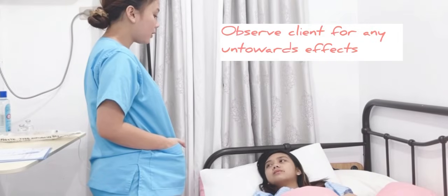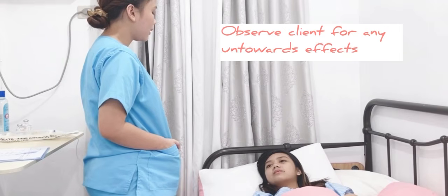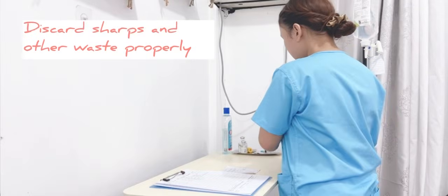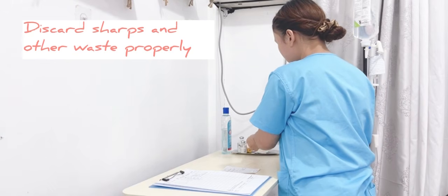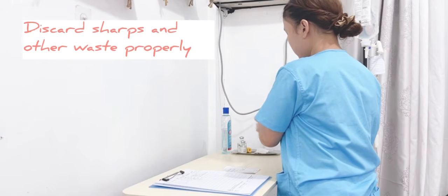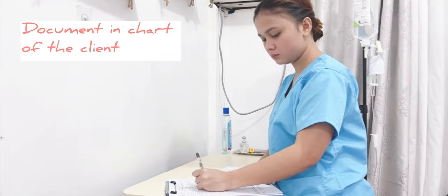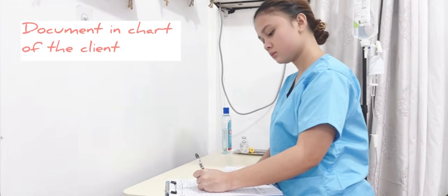Then observe client for any untoward effect. Allows evaluation of undesirable side effect. Then discard sharps and other waste properly. Then wash hands to reduce transmissions of microorganisms. Then document in the chart of the client.